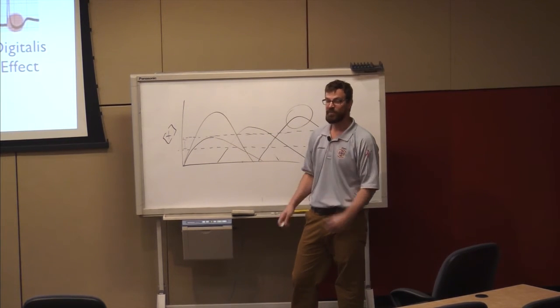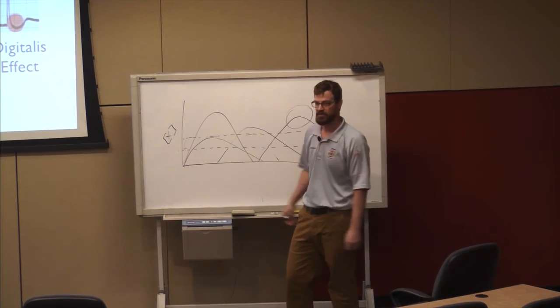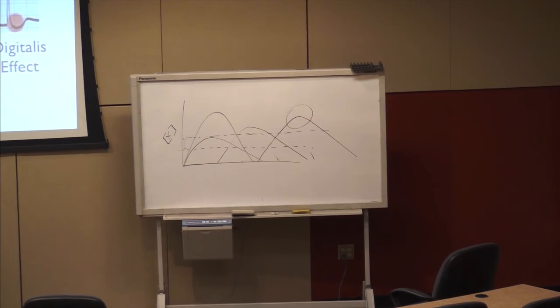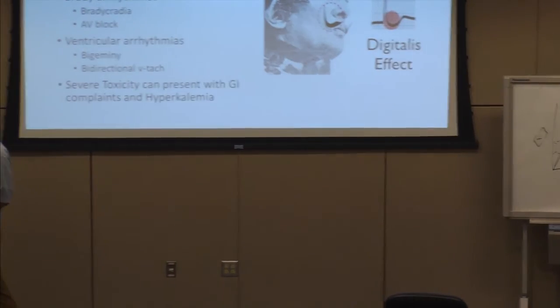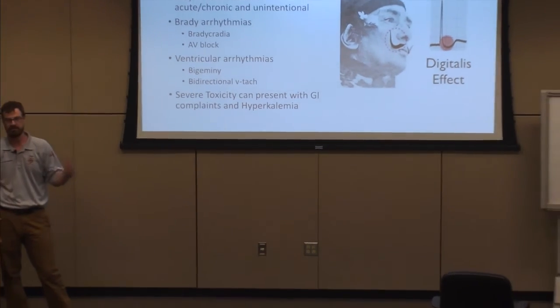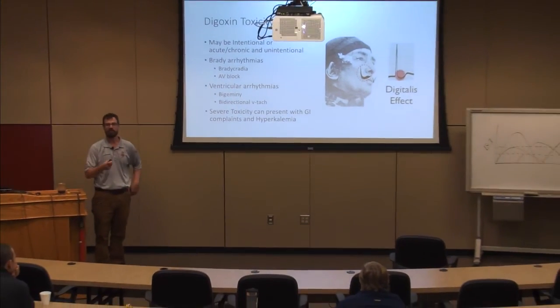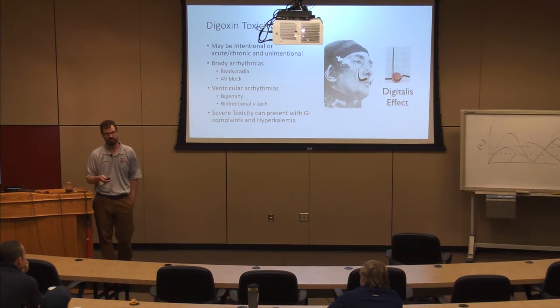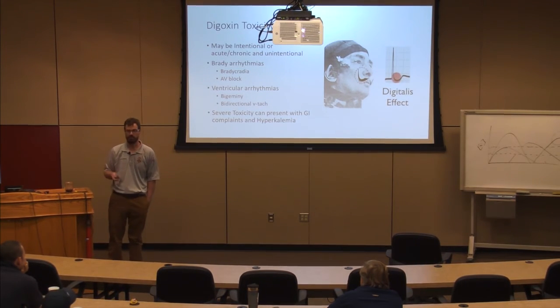So really the most important thing to know is, is there digoxin around? Because any of these could be digoxin toxicity, which requires a special medication called Digibind, which is the antidote, and it binds up digoxin and makes it ineffective. Just had a case in the ER the other day. It was cool. It presented as a bizarre arrhythmia that was wide, and it was slow, and it was nothing else. It just was funky, and you couldn't call it anything. You'd look at it and say, well, that doesn't really fit anything. It's just a weird arrhythmia, and it was dig, which is classic for dig.